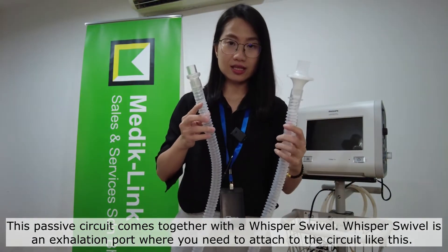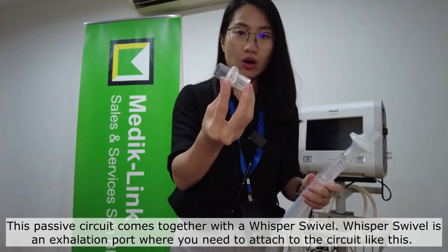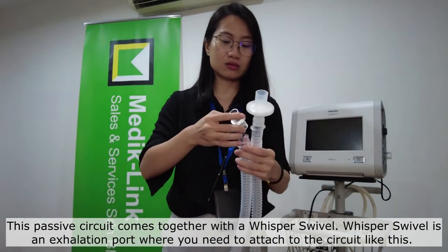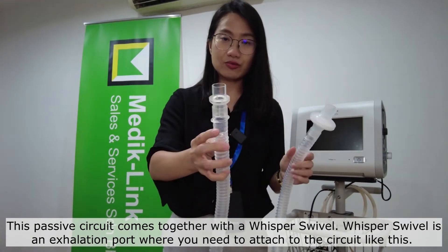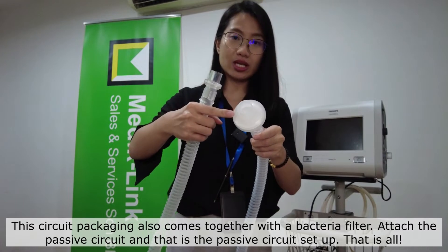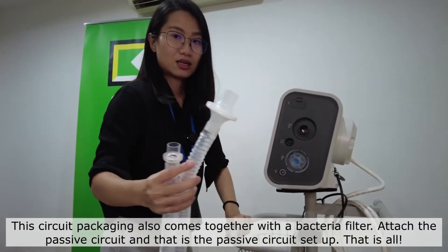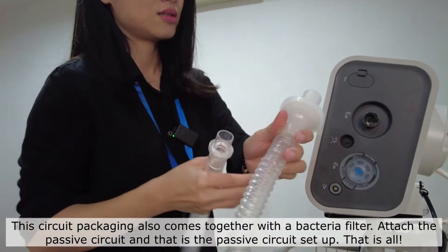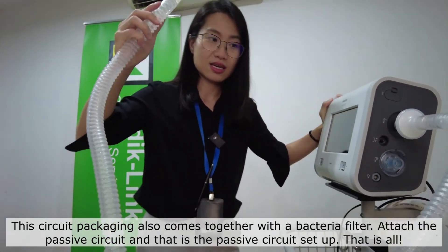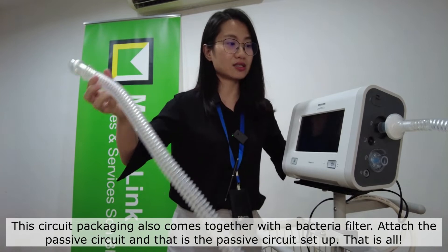This passive circuit comes together with the Whisper Swivel. The Whisper Swivel is an exhalation port where you need to attach together with the circuit like this. This circuit packaging also comes together with a bacteria filter. This is where you attach the passive circuit, and that is the passive circuit setup.